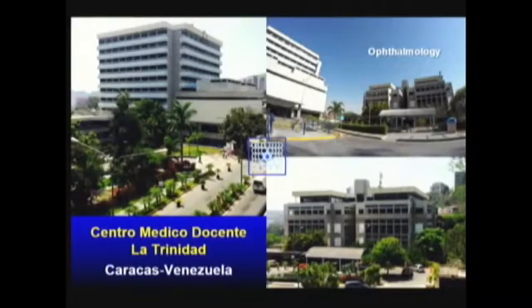In the early 2000s, maybe 1999, 2000, I asked the company to manufacture a 100 plate in order to save more corneal stroma.